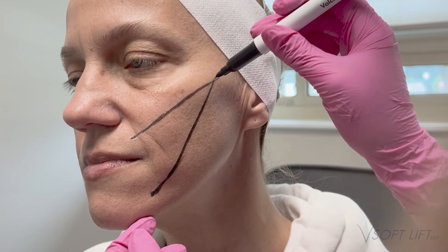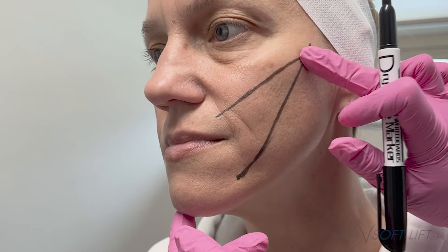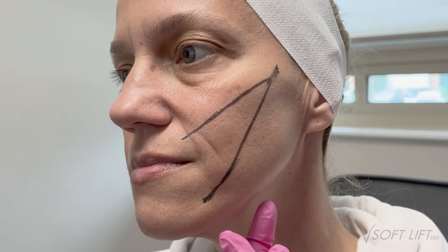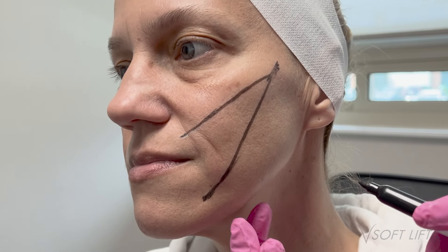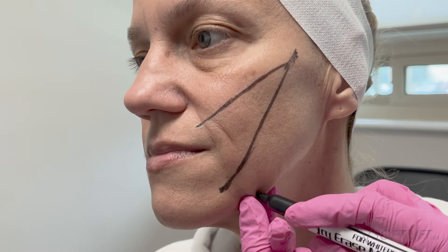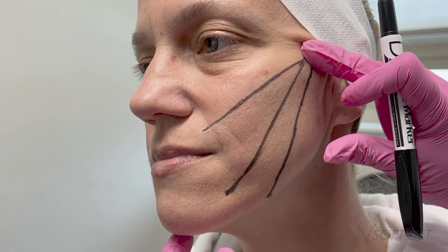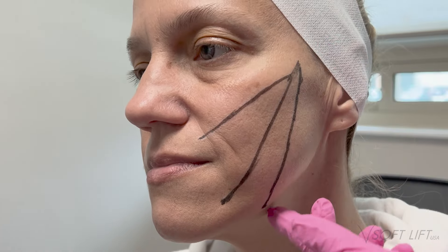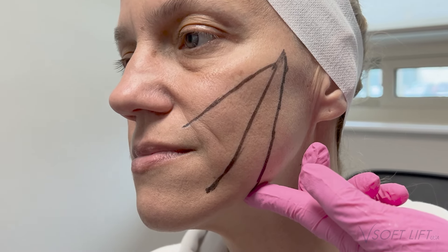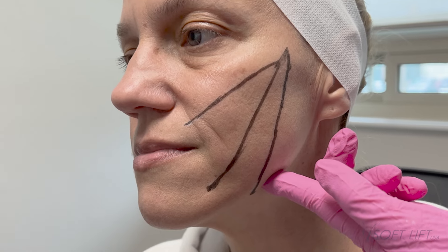Hi everyone, today we're doing a lifting thread treatment for this patient. We're going in with Arte 1, 18-gauge threads. As I'm marking up, I have the patient sit up straight — I really like to appreciate gravity taking effect on the tissue. As you can see, I'm pulling and pinching down by the marionette lines, really trying to evaluate the tissue and see where we're going to get the best lift.